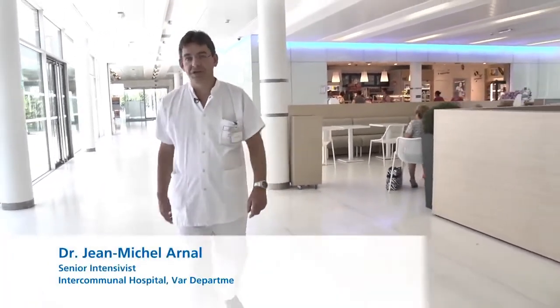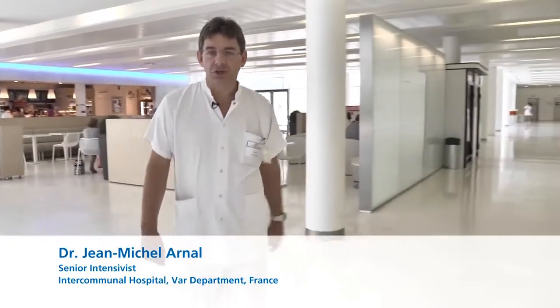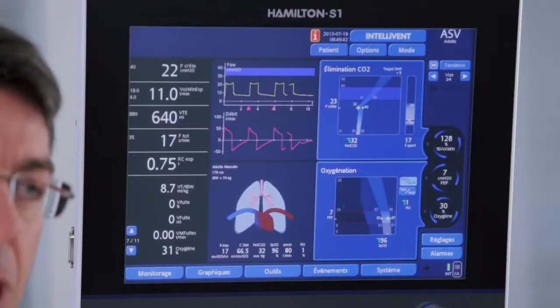I'm an anesthesiologist. I work in ICU. I want to welcome you in this hospital, and now I'm going to show you something very interesting. We are here with the patient, and we are going to see the use of INTELLiVENT-ASV in an ICU patient.